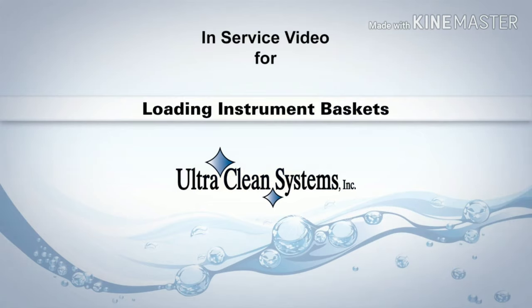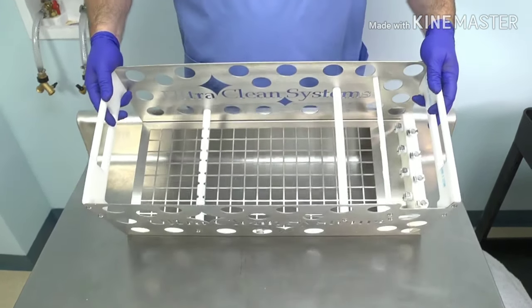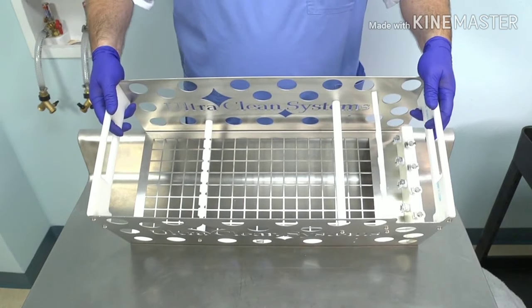This video will demonstrate the proper way to load instruments in the baskets of your UltraClean Systems machine. Although the baskets from different models may vary in size and shape, the same procedures should be used when loading instruments.